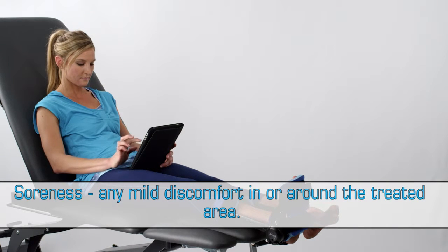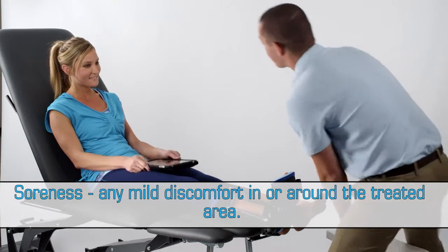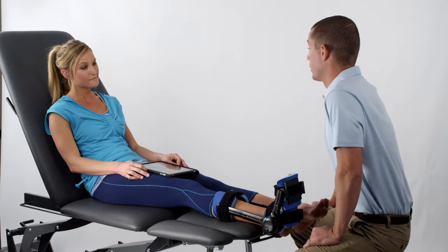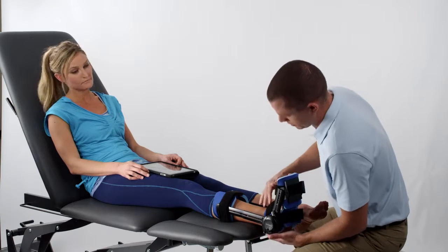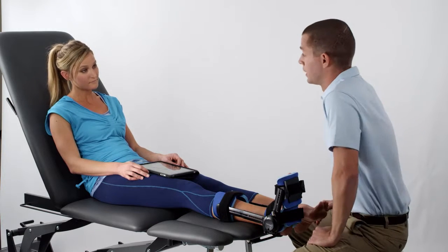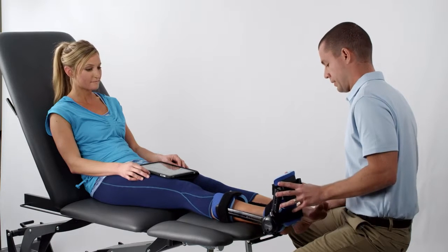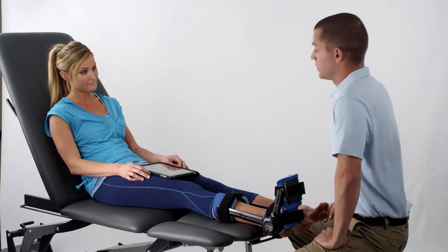The decision to increase wear time should be based on patient tolerance and may be accomplished over a few days or longer if necessary. Once a patient has achieved their wear time goal, a steady increase in tension on the device may be required to achieve range of motion goals. If there is minimal soreness and no range of motion gains have been measured, then tension should probably be increased. Increase the tension gradually, no more than 1 increment per evaluation. Also, make sure the patient is maintaining the required wear time per day and adhering to the post-wear criteria for soreness.